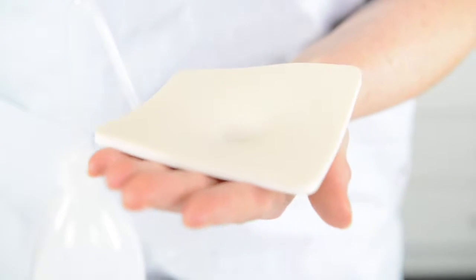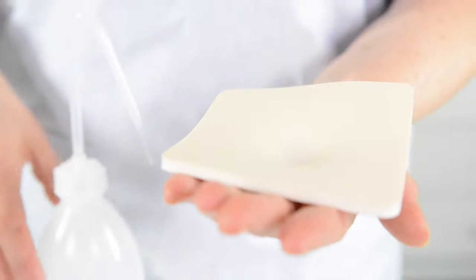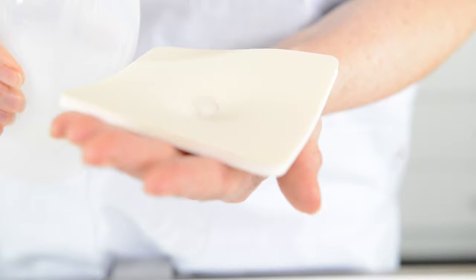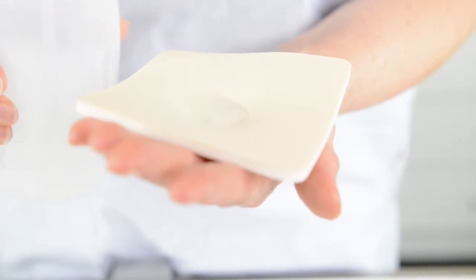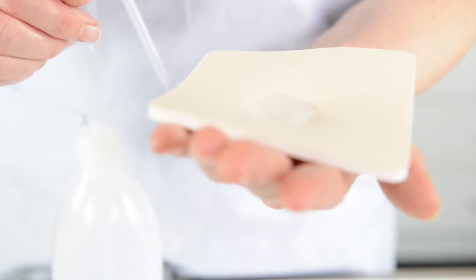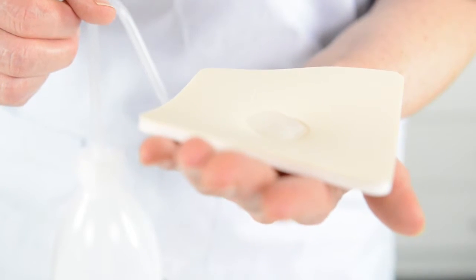Bacteria cannot enter into the foam. It's also water repellent from the outside — you can see it here; water will not be absorbed when you put it on the foam. Air is permitted to go both ways, both in and out of the foam.